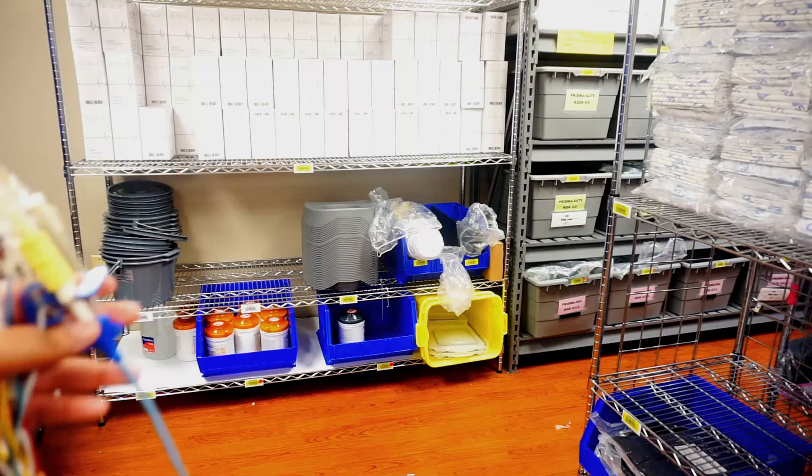So, we have our Swan, which is inserted into our cordis right now.